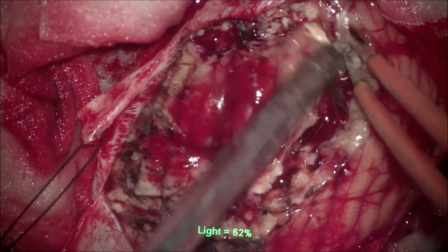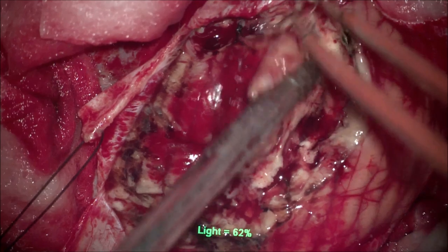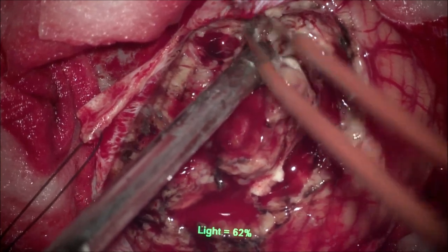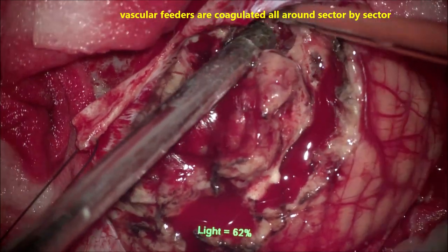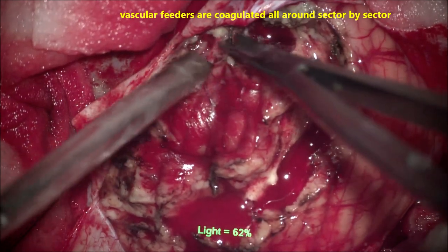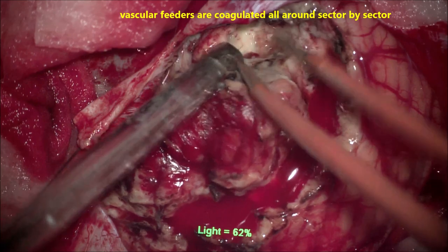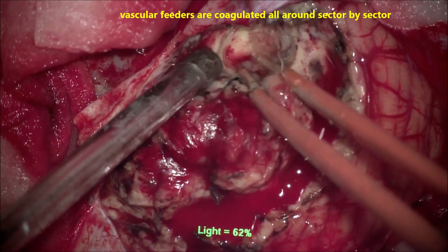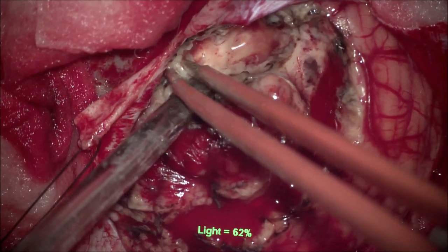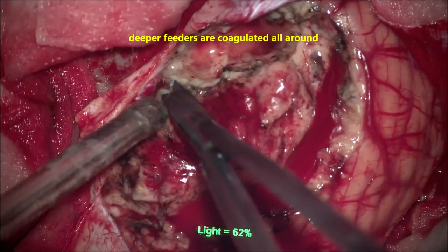From the periphery of the tumor, we need to slowly coagulate from surface to deep and from all sides. The blood vessels entering into the tumor need to be coagulated. One has to be very careful because not only the major feeders — the capillaries also keep feeding. This is very important to prevent post-operative intracerebellar hemorrhage after excision. Superficial to deep, circumferentially, we keep coagulating the vessels slowly and with a lot of patience. A nonstick bipolar is usually recommended in such cases.